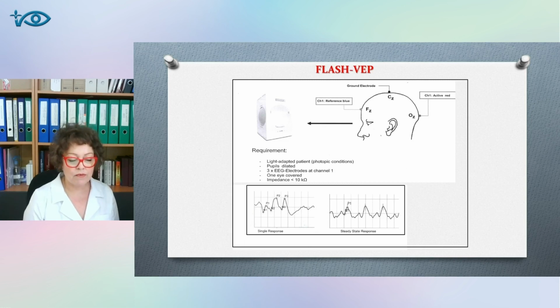In the literature, there are works confirming that the early components P1 and N1, appearing on the 10th to 15th millisecond after the stimulus, are due to extracerebral sources, namely retinal neurons. Prong P2 characterizes the conduction of bioelectrical potential from the retina to the brainstem, including the lateral geniculate body. The N2 wave, which occurs 20 milliseconds after the stimulus, reflects the conduction of the potential from the brainstem to the visual cortex, and the late components P3, P4, N3 and N4 with latency above 100 milliseconds are cortical responses.